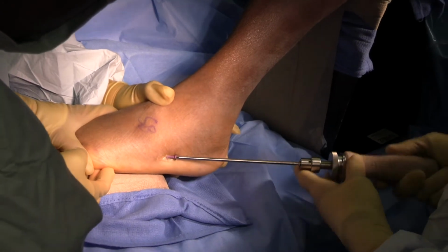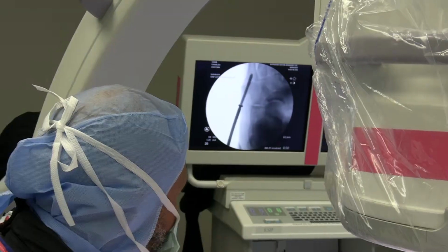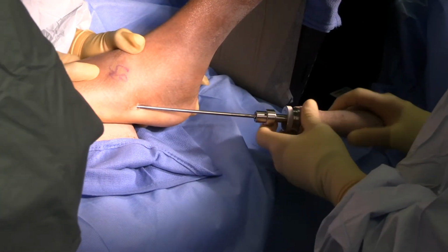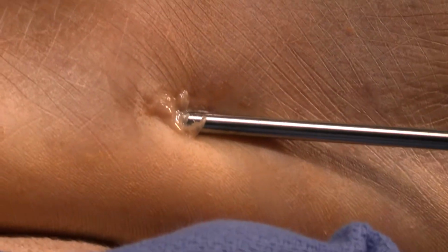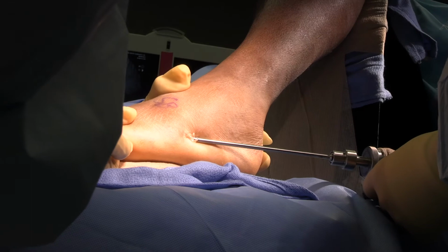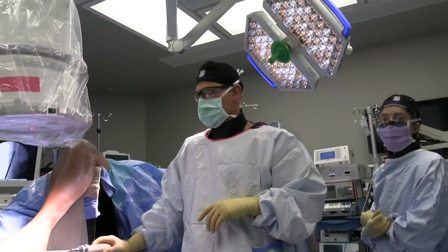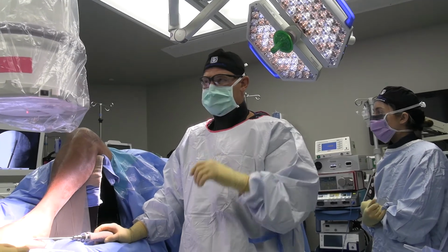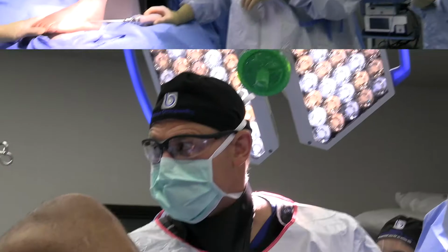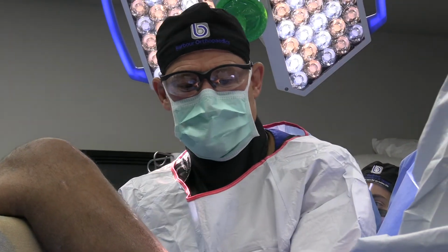Staying right down the pipe. Okay, now my threads are past the fracture site, and that's really all I need to get compression. So now the screw is actually, I can feel it engaging the bone, and it's compressing each time I turn. It's a little harder. I like to leave the screwdriver in the screw until I'm 100% positive that I'm in the right spot. It saves me the fiddling of trying to get it back in if I need to do something. The screw is across the fracture site, and the fracture is now compressed.